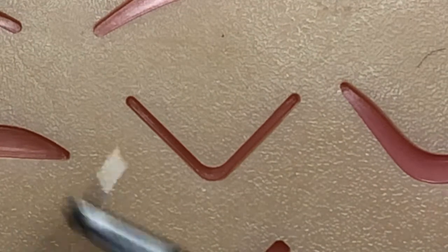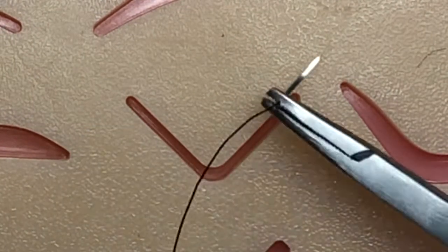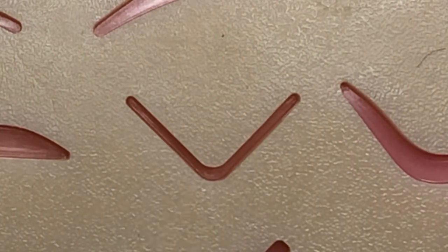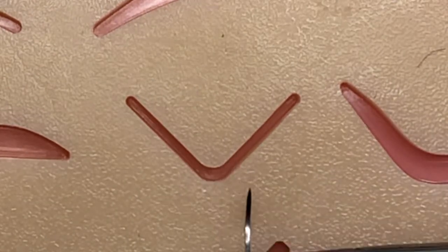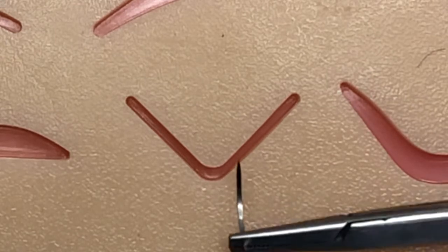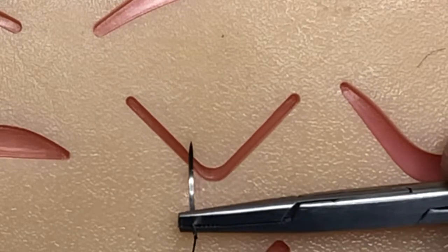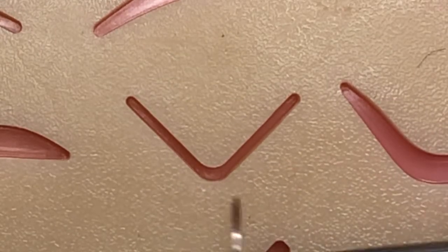If it's a larger, more broad piece of tissue that's coming across here, you could consider doing a horizontal mattress stitch. So that would be coming in here, tying across a little bit, and then coming back and then tying right there.